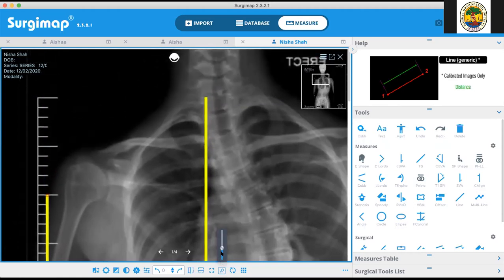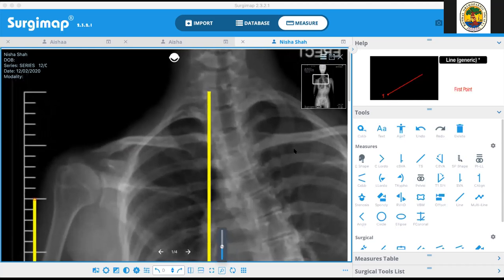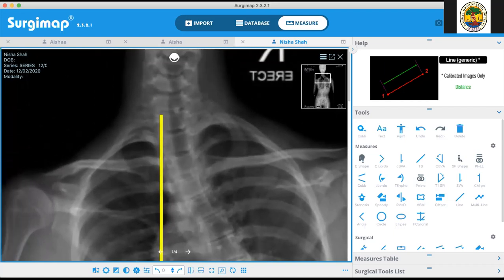So that's why it's taken from the edge of the screen, so that these minor errors are not accounted for. But if there is a major error, then you have to actually take the X-ray with a shoe raise. You cannot do deformity planning with a pelvis that is kept very oblique because of a limb length discrepancy. That's the whole idea. Yeah, but that will not actually represent the vertical axis of the body.